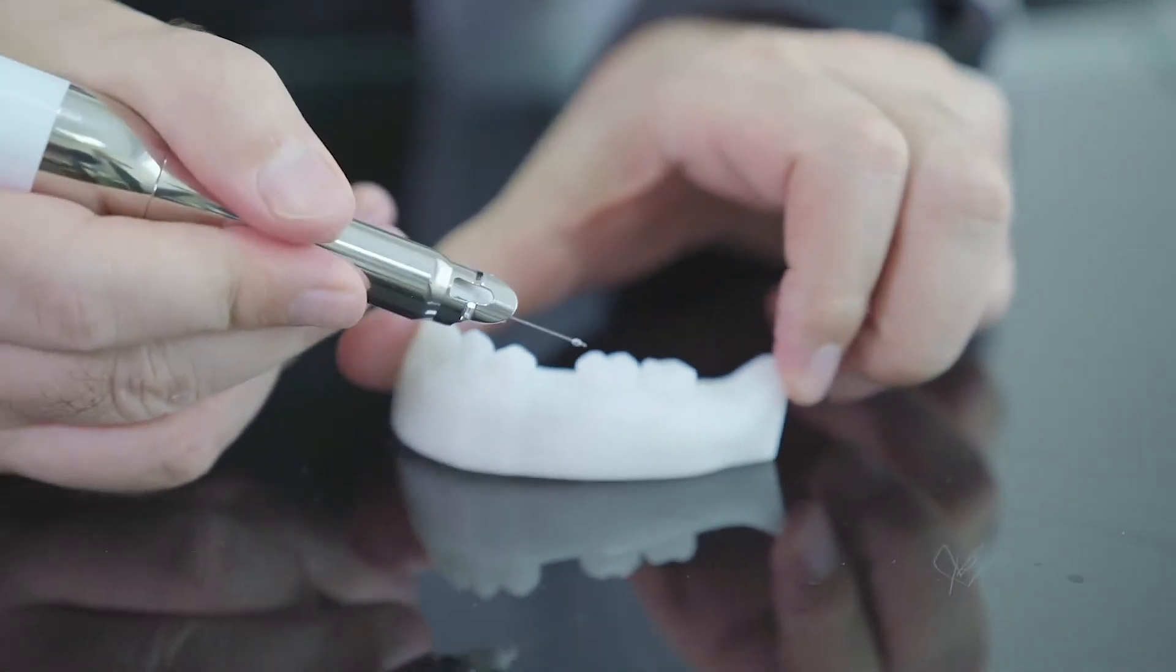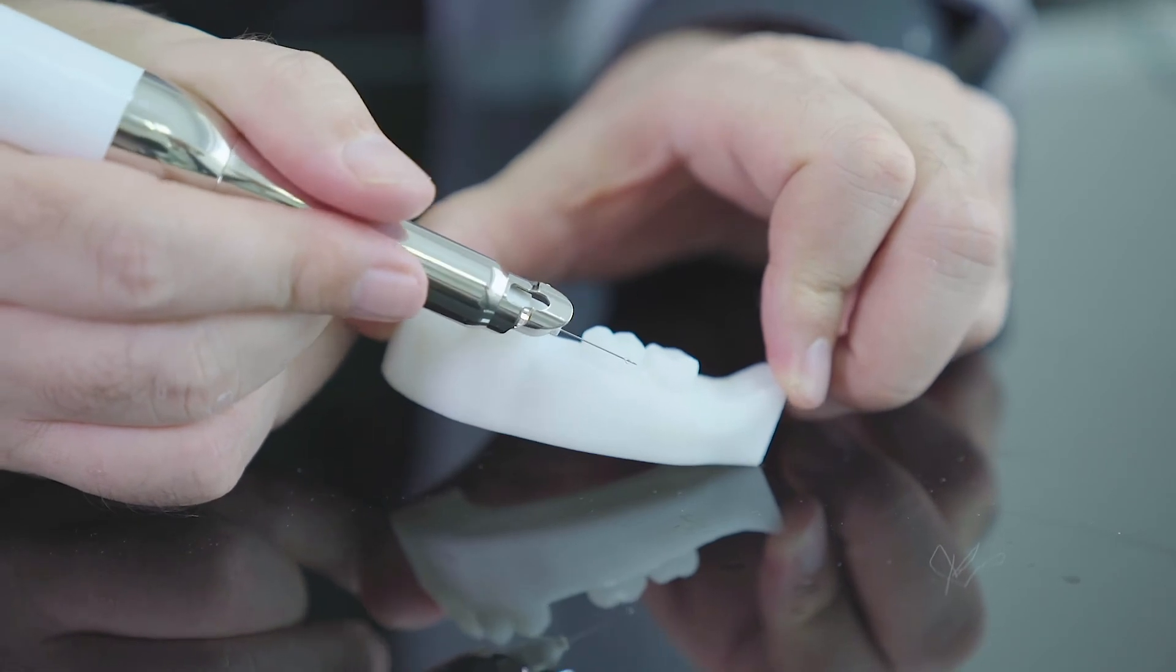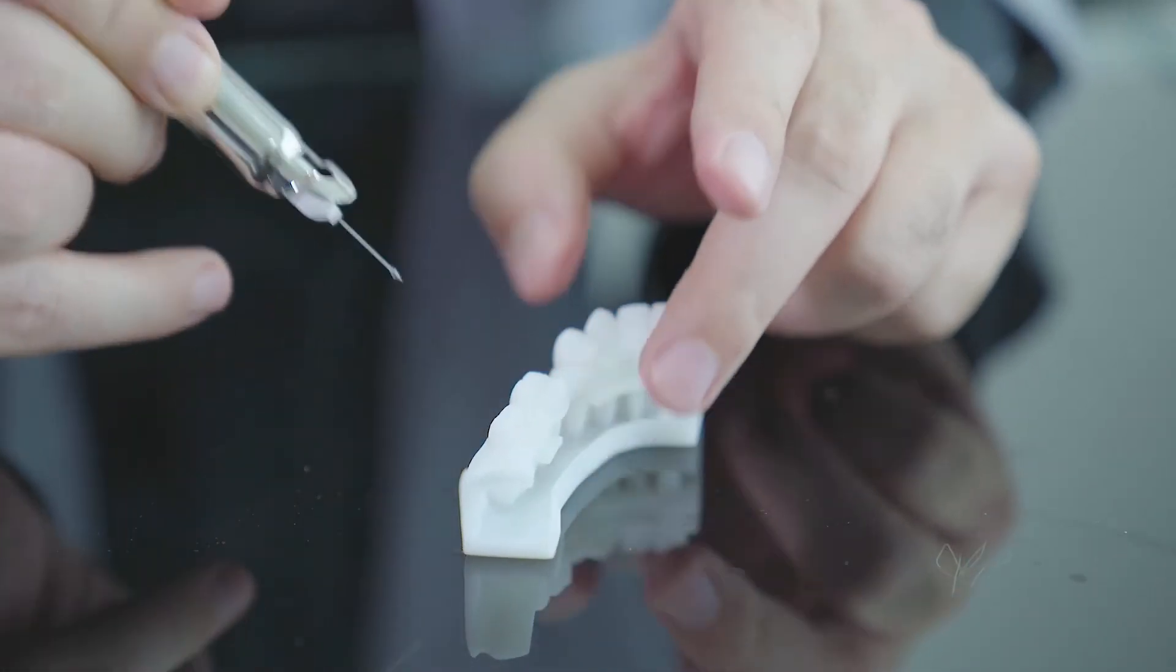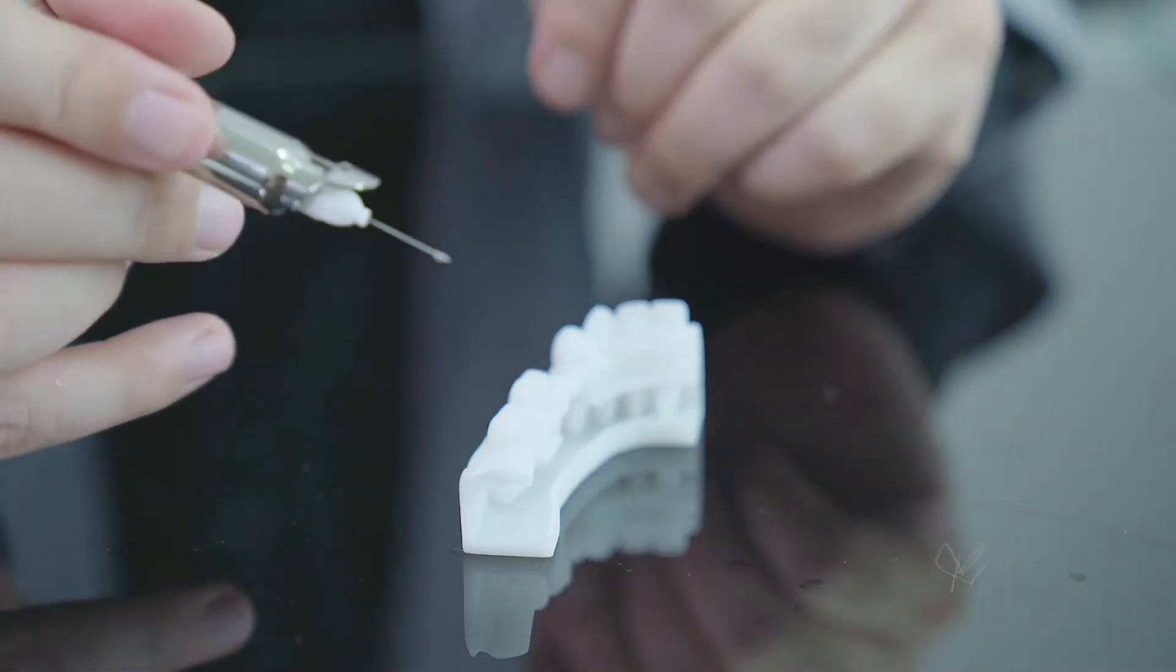So simply penetrate, go to the tissue, anesthetize. Second, drill the bone, then inject inside the cancellous bone. That's all with Quick Sleeper.